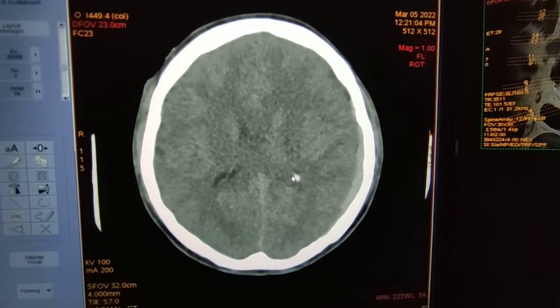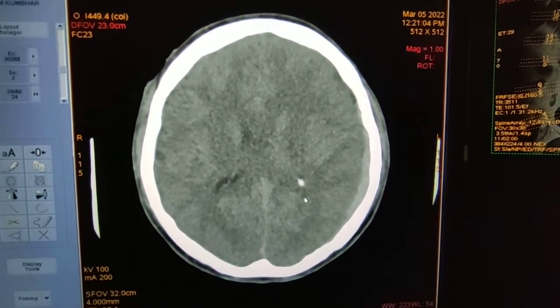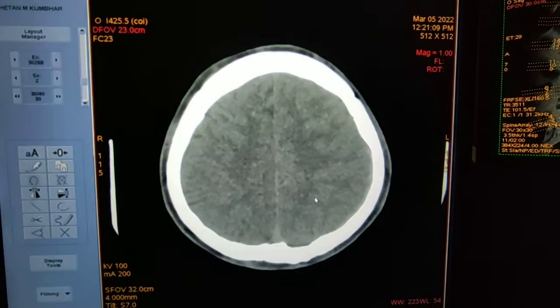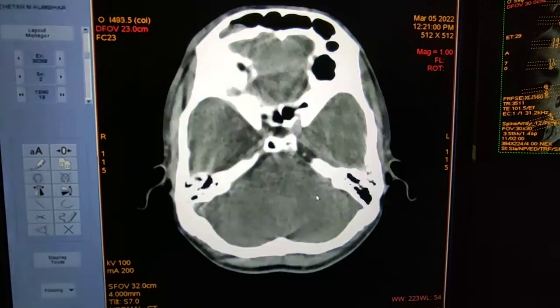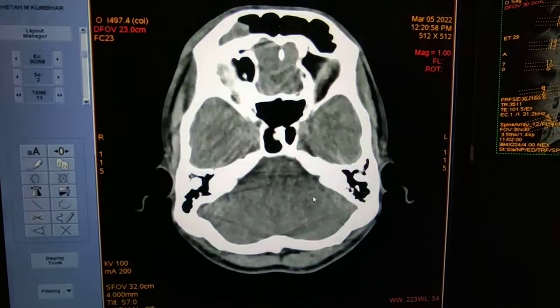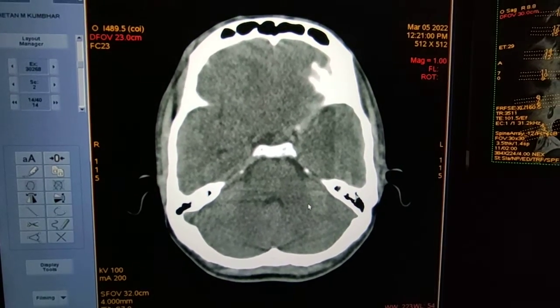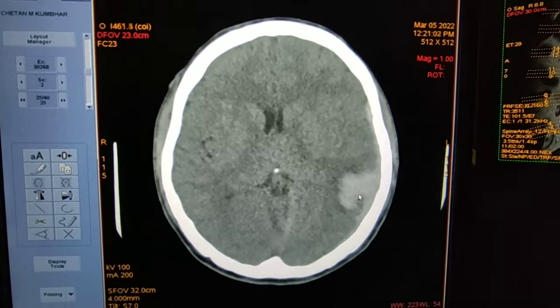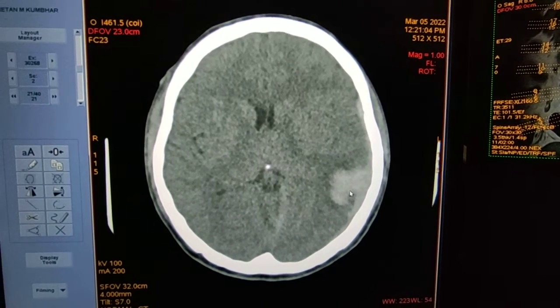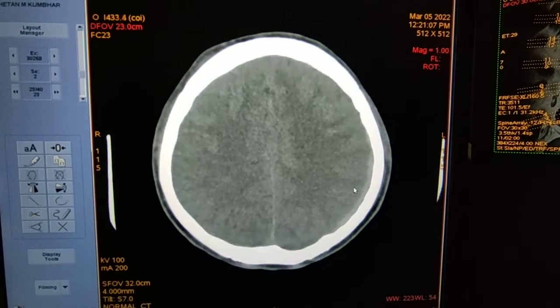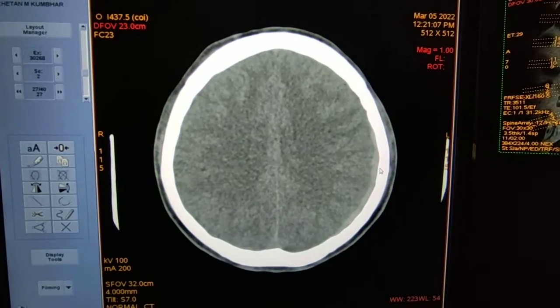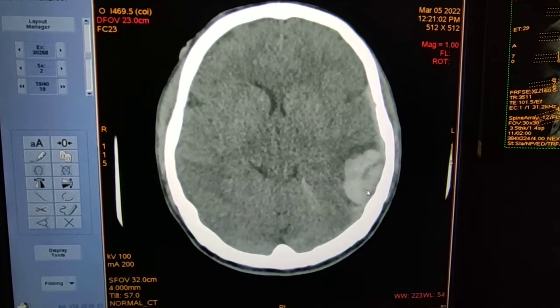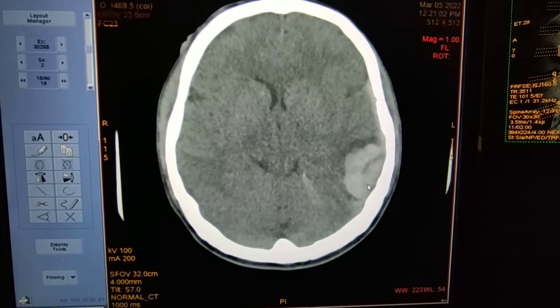This is how you can read a CT scan brain of a traumatic patient. This patient is having tentorial plus inter-hemispheric hemorrhage, thin subdural hematoma, and medium to large size hemorrhagic contusion. This is a thin strip of subdural hematoma. Thank you.